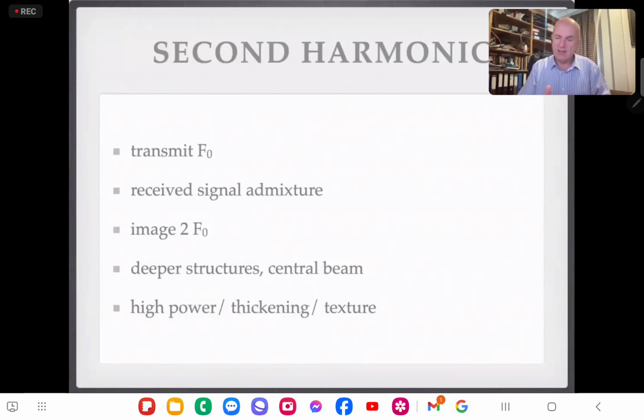So that in the same way as the kids change as they go through life, the beam changes as it goes through a medium because it interacts with the medium around it. And mathematically, you can describe that as the beam stops being just 2.3 megahertz, but becomes a beam that's 2.3 megahertz with a bit of twice that, so 4.6, with a bit of 3 times that, 6.9 megahertz, and so on. So you stop just being a pure 2.3 and you get some 4.6 and 6.9 and so on and so on.